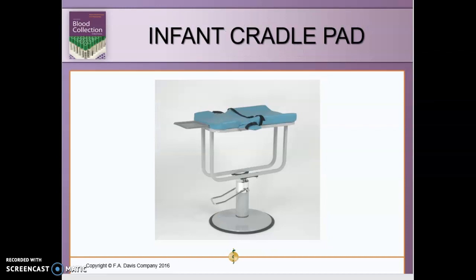This is an infant cradle pad, just to give you guys a visual. So when we're collecting blood off of an infant, this is what they use, and they're able to strap them down to keep them from jumping and running the risk of injuring themselves.